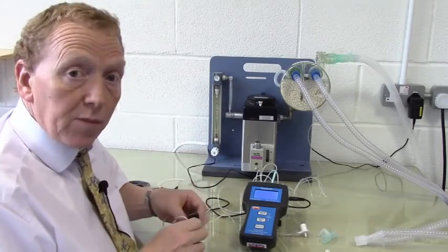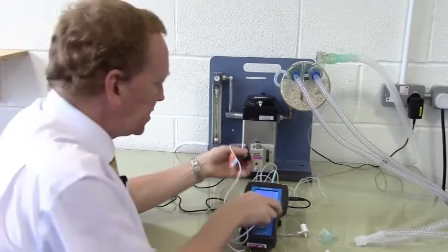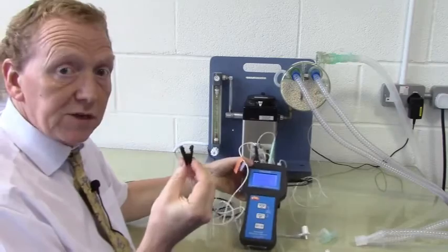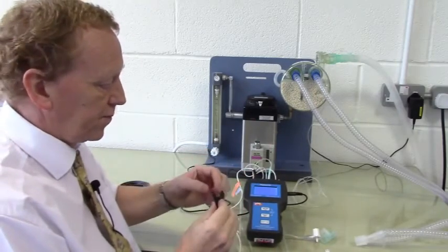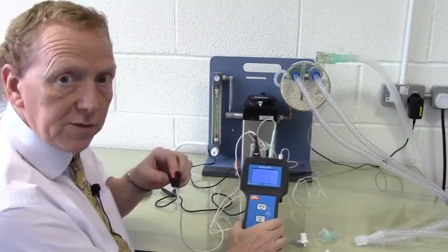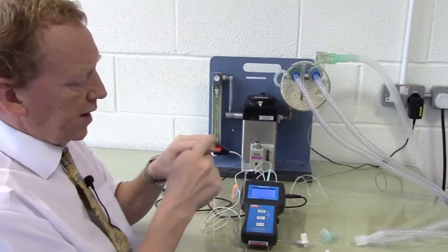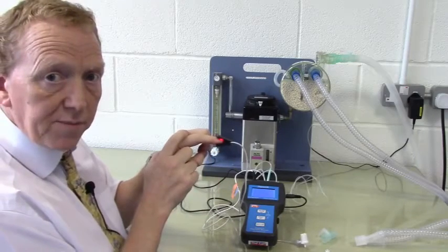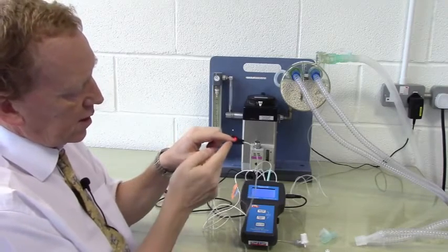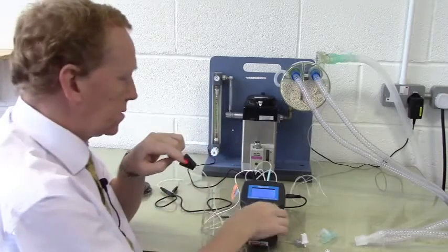One other module of the Impact 3 is the pulse oximeter. This simply plugs into the rear, and we supply either transmission clips or reflectance clips. I'm sure most people are familiar with the use of pulse oximetry, but the clip goes with the light emitter at the open end, the most open part of the contact area, and the sensor at the most closed part. So here the fleshy part of the finger is closing over the sensor, and this should be at the lower part.